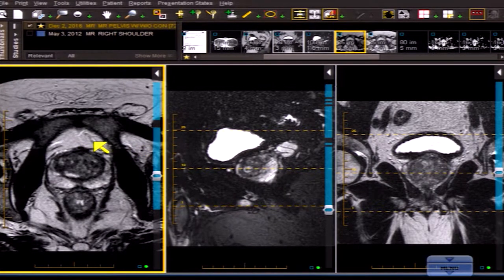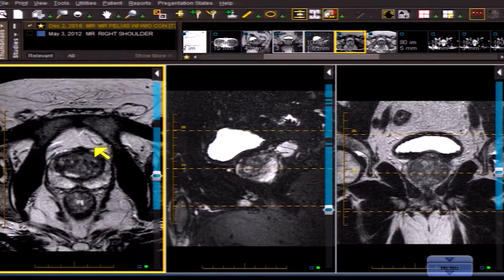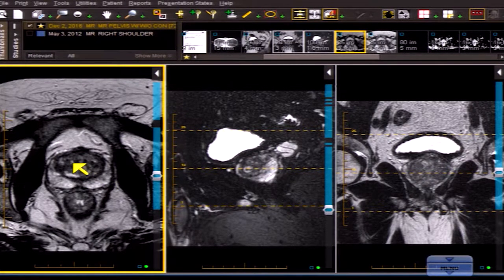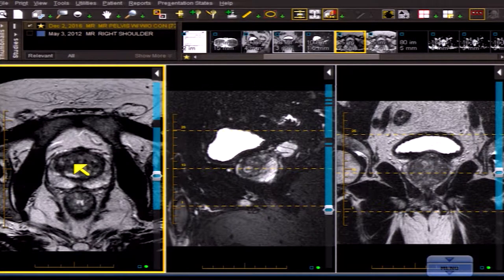My purpose in this vignette is to introduce you to some of the descriptors — some of which you're familiar with from breast imaging or MR if you do it. Let's start with the term 'focus.' A focus is more of a pinpoint area — like a little white spot. It is a localized finding that's distinct from neighboring tissues and is not three-dimensional or space-occupying; in other words, it doesn't have mass effect.